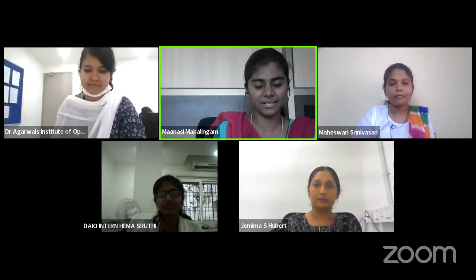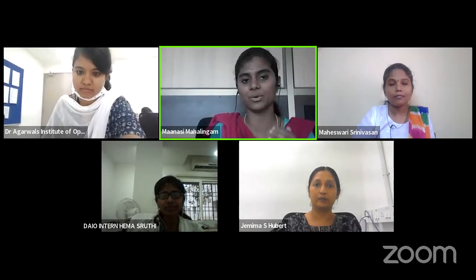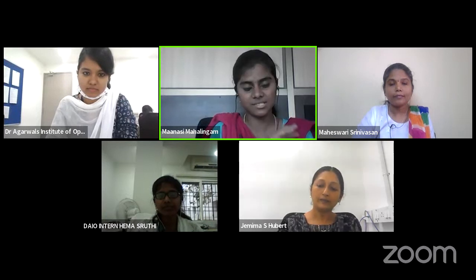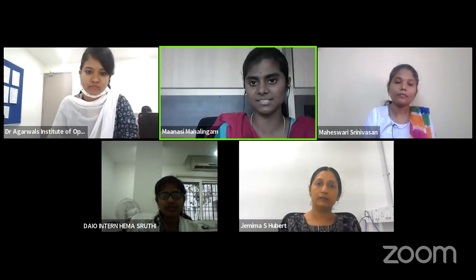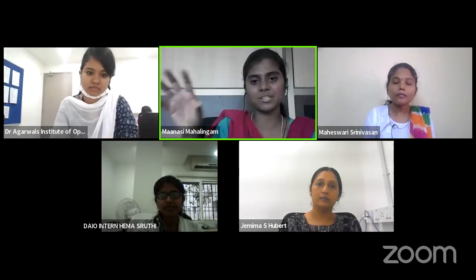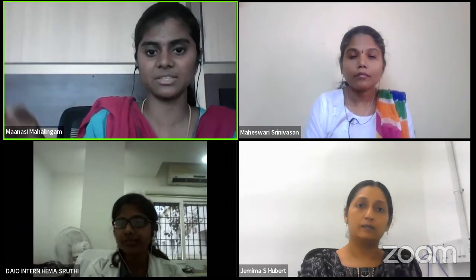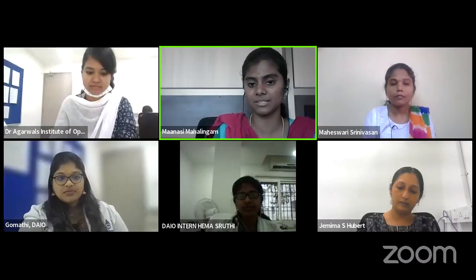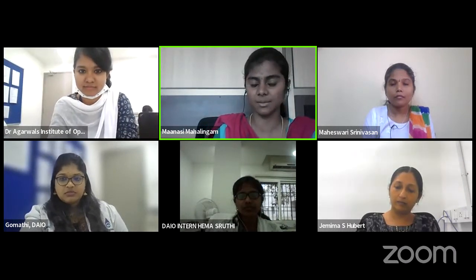Okay. So we as optometrists are responsible to interpret whatever report the patient brings to us. So if you get to see any OCT report, just see how it is, because the most common finding in the retina is diabetic retinopathy. So you have beautifully posted how the hard exudate looks. If you get to see any patient, always start with the normal foveal contour, and then also you should end with the other two quantifying biomarkers, which I think you have listed in your presentation: the foveal thickness and subfoveal choroidal thickness.